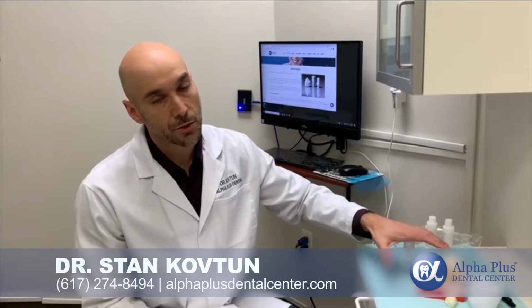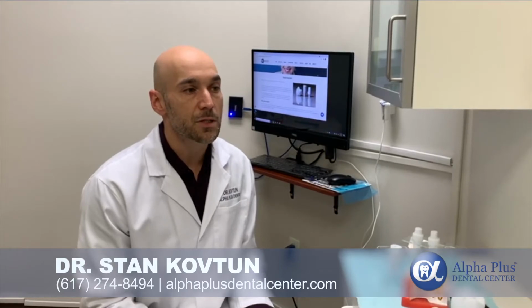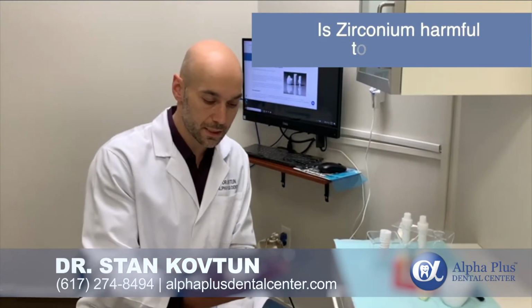Titanium implants and zirconia implants have a rate of success of about 97%, but the patient has to understand they have to clean it, they have to floss it. There's a lot that goes into maintaining your natural teeth, as well as anything prosthetically that a dentist can do for you.